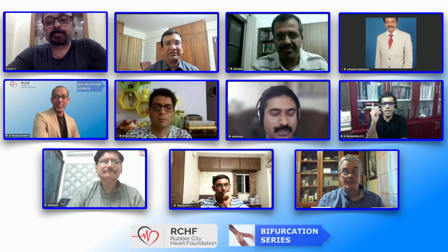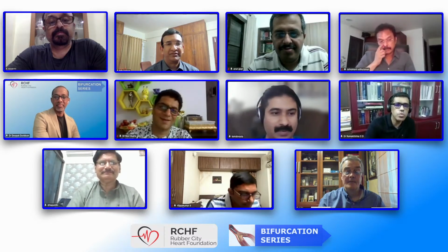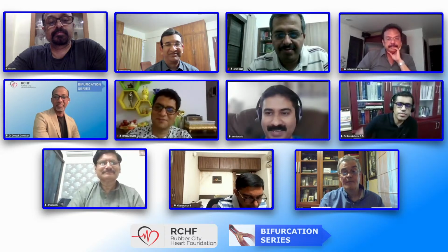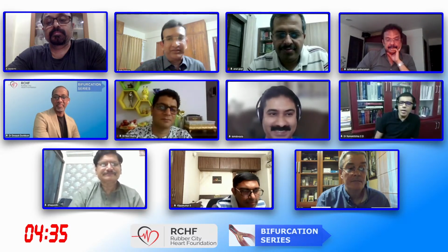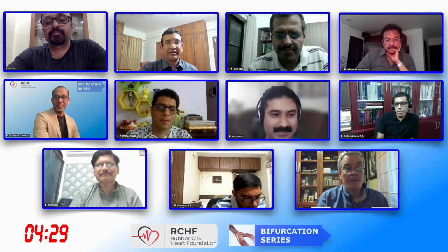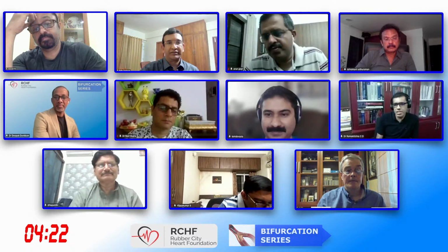Your lecture is so lucid and clear that even the basic interventionalist will understand all the concepts very clearly. Thank you so much. Sir, as usual, wonderful presentation. But is it mandated to do pre-dilatation of both the main vessel as well as the side branch, because sometimes we may produce dissection and sometimes you have to change your strategy. So what is your opinion?